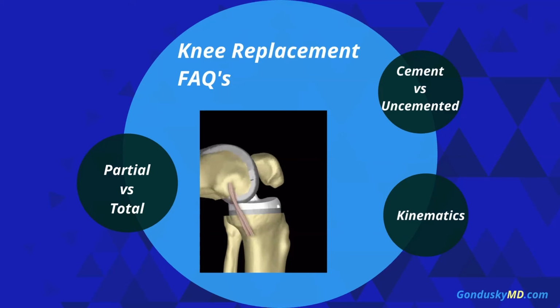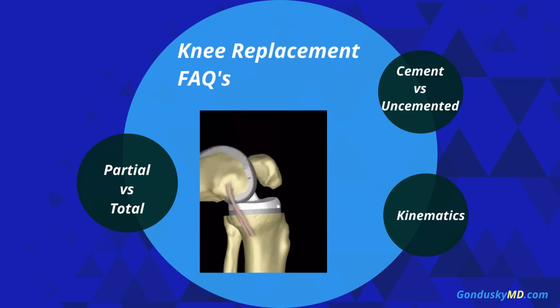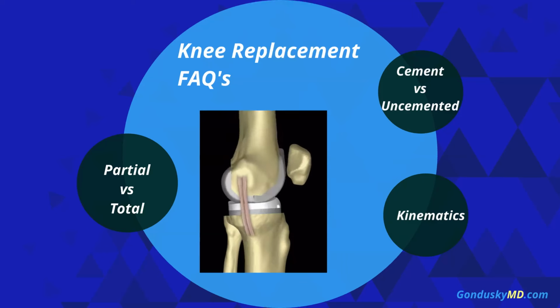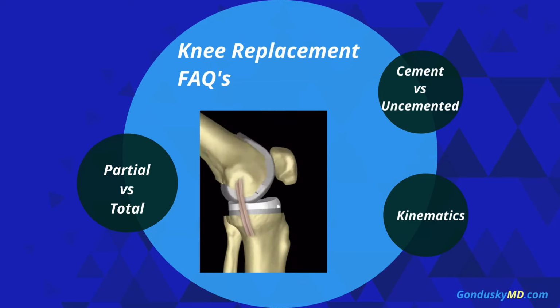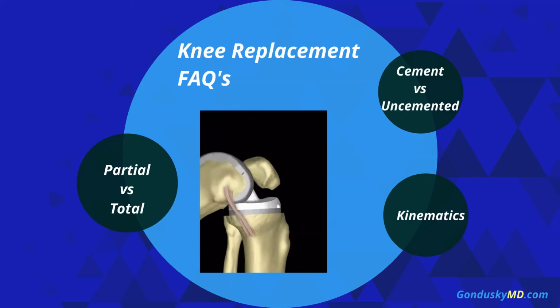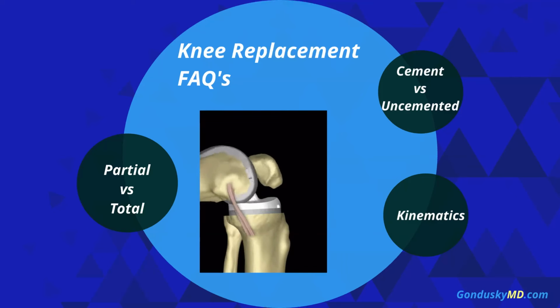There are a lot of younger patients having joint replacement and specifically knee replacement. And so one common thing is that younger people really want to be active and ask if there are higher performing implants for younger people. The answer to that question is kind of yes and no, I guess. There are newer implants, especially newer plastic pieces in the middle, that provide probably better stability, which I'll talk a little bit about in the kinematics talk.